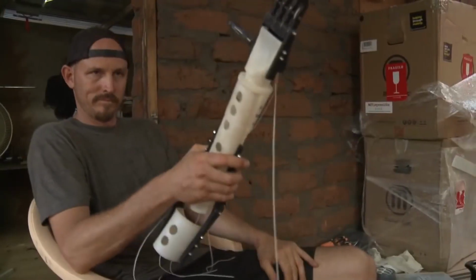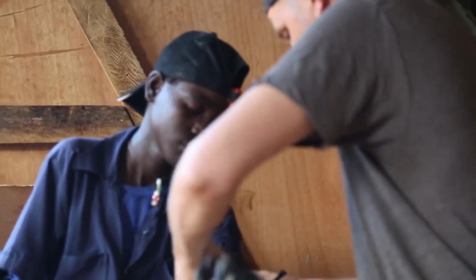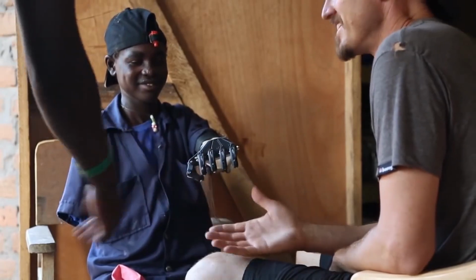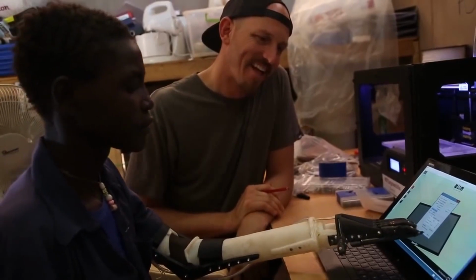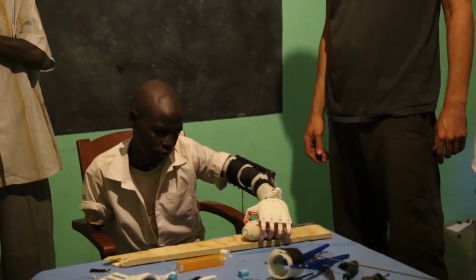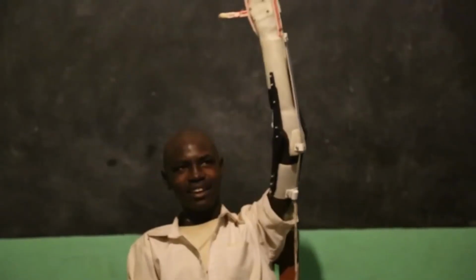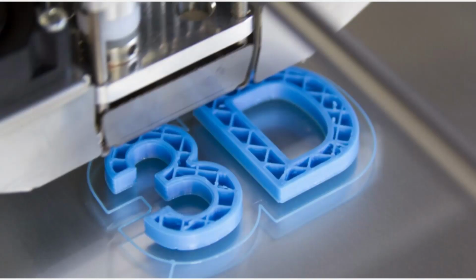In underdeveloped nations, there are about 40 million amputees, yet only 5% of them have access to prosthetic limbs. The expense of traditional prostheses, which may vary from $1,500 to $8,000, according to the American Orthotics and Prosthetics Association, is prohibitive for the majority of amputees. Hence, 3D printed prosthetics can be an excellent alternative to conventional prosthetics since they can be purchased for as little as $50. Also, utilizing 3D printing, it is feasible to create prosthetic limbs more quickly.